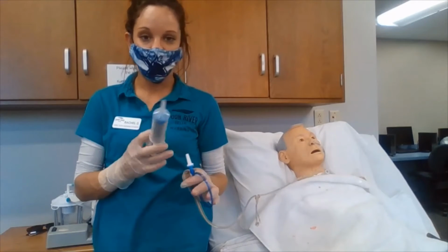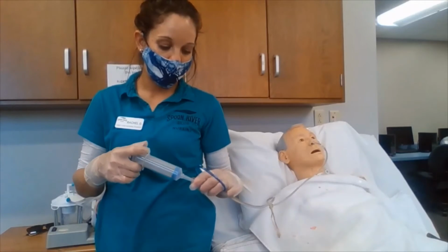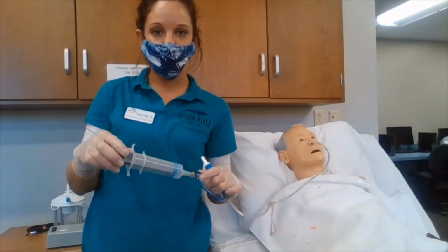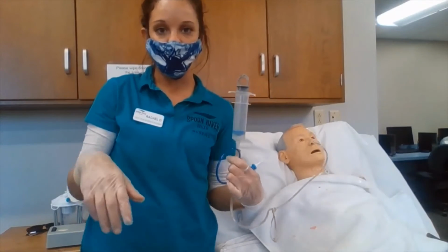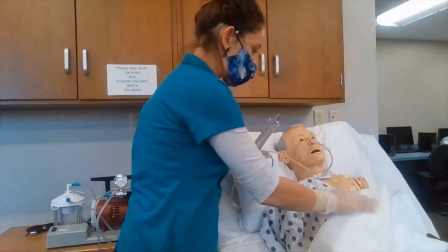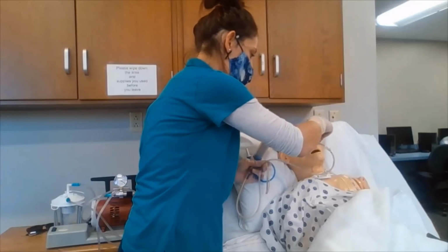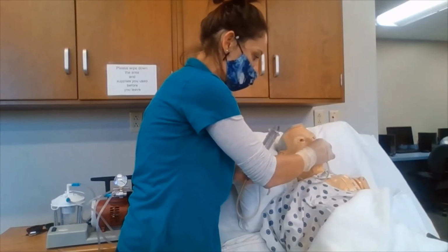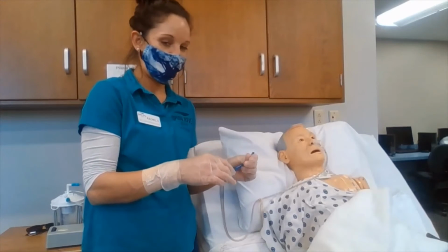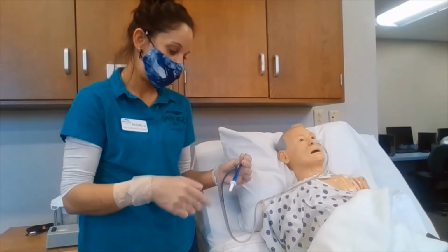So after we have disconnected the tubing, we are going to be flushing out the tubing with 10 milliliters of air or normal saline solution. We're going to be unpinning our tubing from our patient's gown. We're going to be removing the tape. We can use the adhesive remover to remove the tape. If we are right-handed, we're going to be on the patient's right hand side and opposite for the left-hand side.